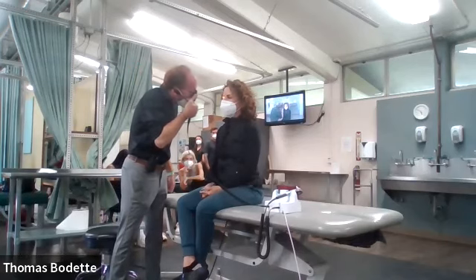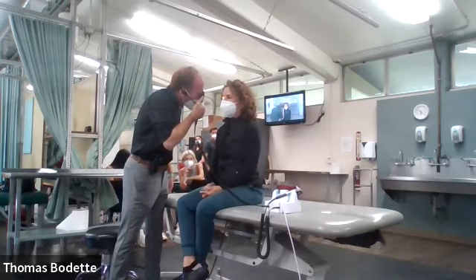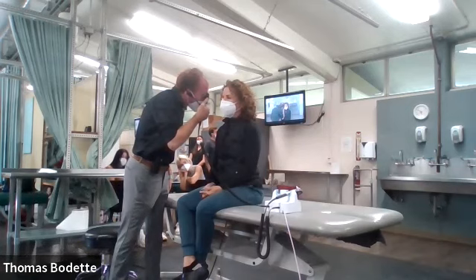And then the closer you get, you want to refocus to posterior structures. And you want to go very slow until the first thing you see are arteries and veins. And they're gonna pop into focus.